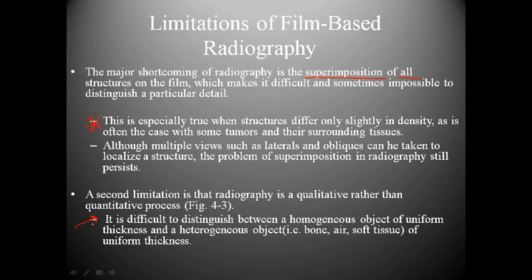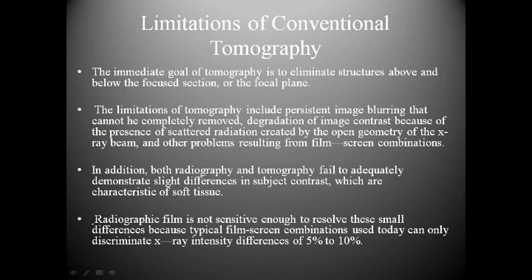And we see that with radiography. You really can't distinguish parts of the colon based on just conventional radiography. Things like this become very, very limiting. And that's why we see that there had been developments to try and get around this. And so this brought about conventional tomography, not CT per se, but just tomography in general. That's what spurred tomography to be developed.